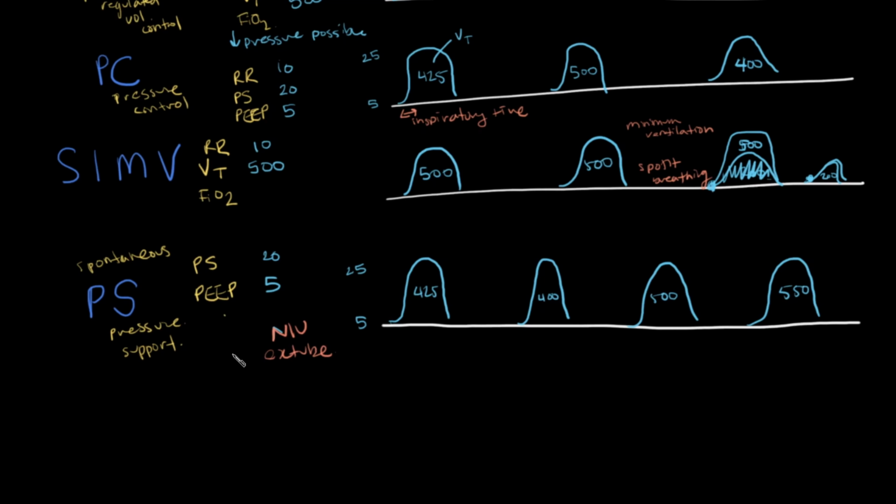But generally, if this is a non-invasive ventilation trial, then you're just seeing whether you will find some improvement with these settings and all the respiratory and cardiovascular effects they give to patients, like we discussed in our first video, before maybe progressing to actual invasive ventilation if that's necessary.